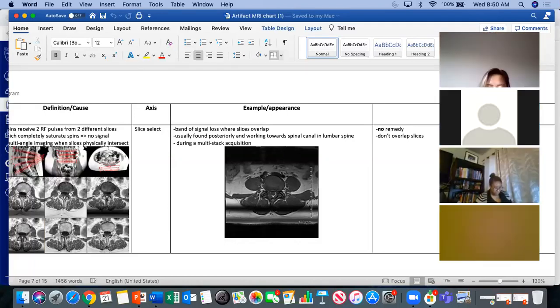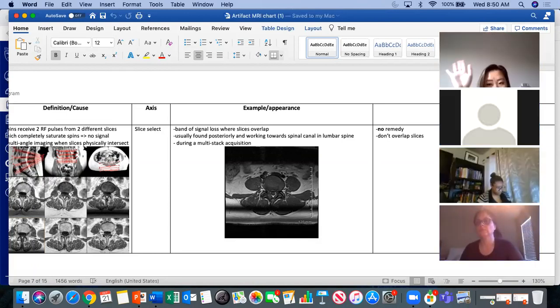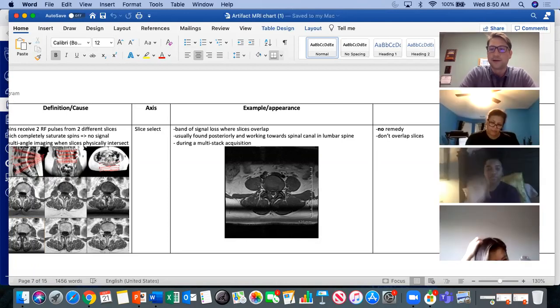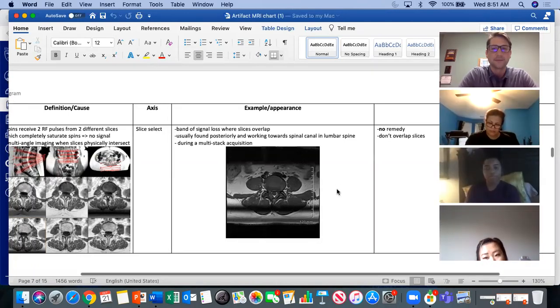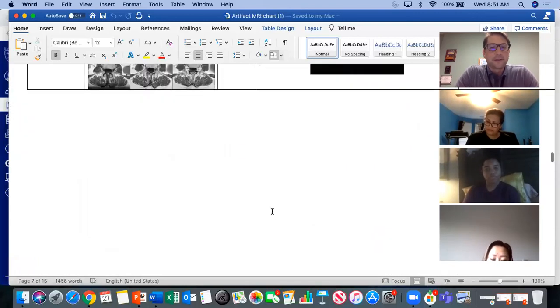So who has seen that kind of action where they've maybe done 2 stacks, one up where the L-spine's a little straighter, and then another one where the L-spine's really curved down below? Any hands seen that one before? Yeah, so Rosemary, Marcavia. So you guys have kind of seen that. So that's the reason behind it. All right, so let's move on down.